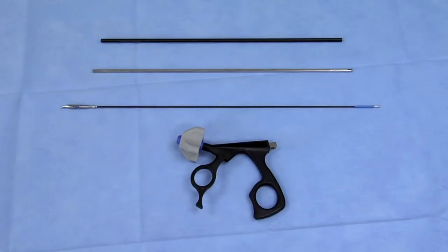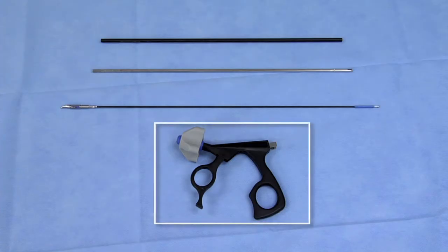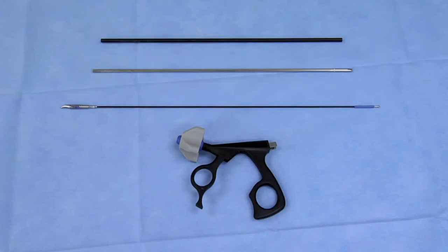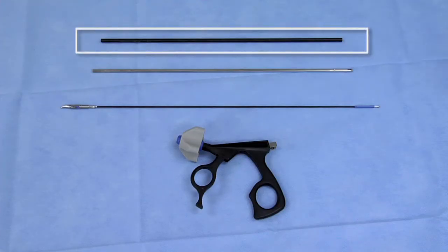Esculap Sovereign Bipolar Laparoscopic Instruments are comprised of the following components: Handle with Rotation Knob and Moveable Handle Component, Jaw Insert, Inner Metal Tube, and Outer Insulation Tube.